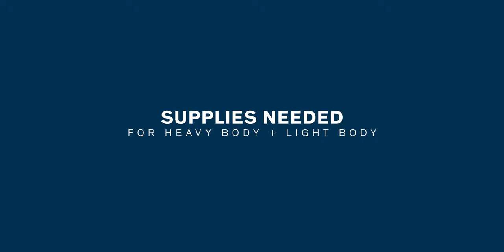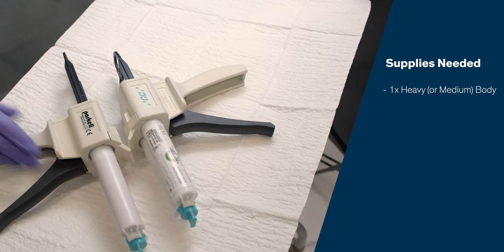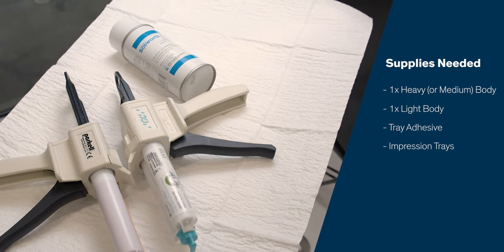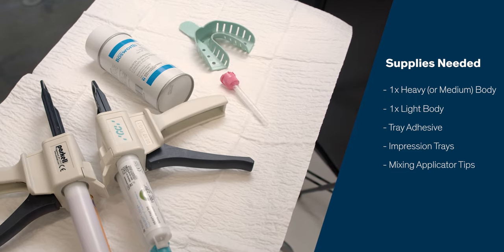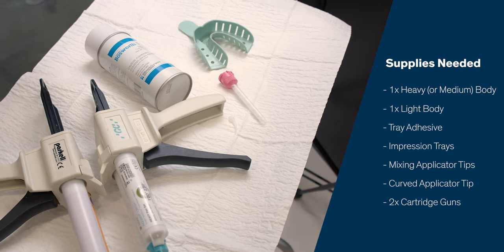One cartridge of heavy body PVS material, one cartridge of light body PVS material, tray adhesive, upper and lower disposable impression trays, plus the applicator tips, the curved applicator tip, and two cartridge guns.